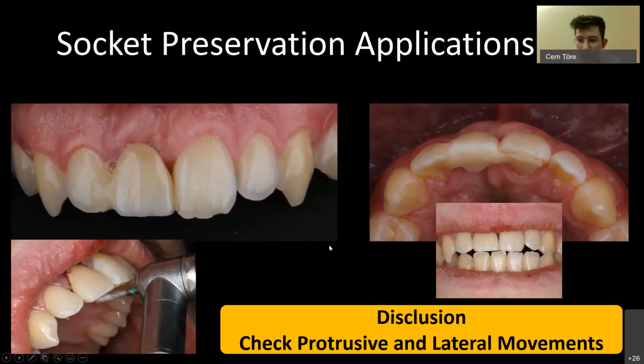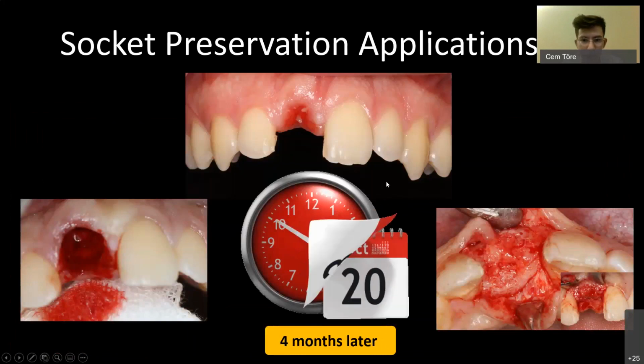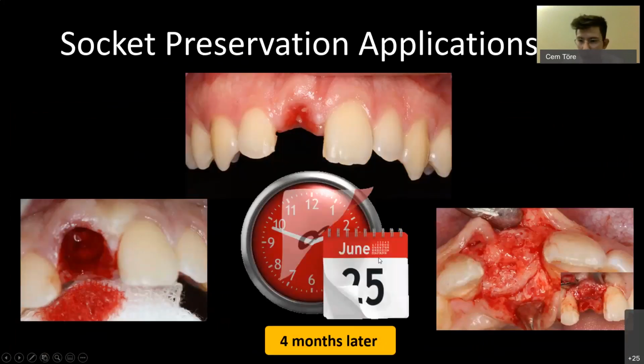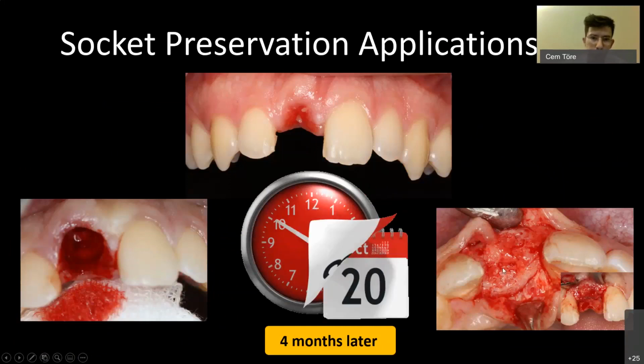And this is our end result. 4 months later, we are ready to place an implant in that region. And we can see just how much bone volume, how much bone width we have here.